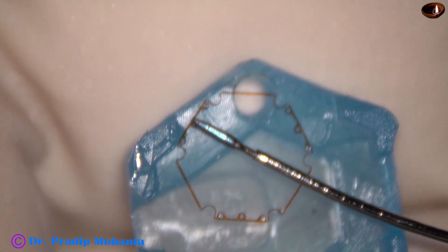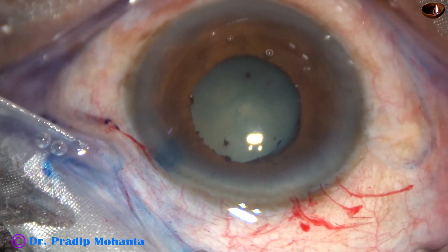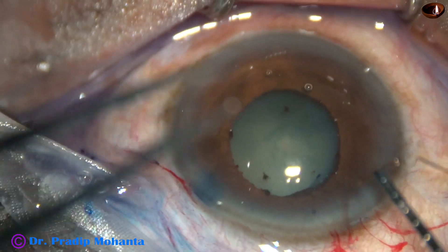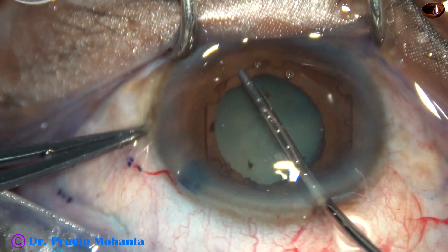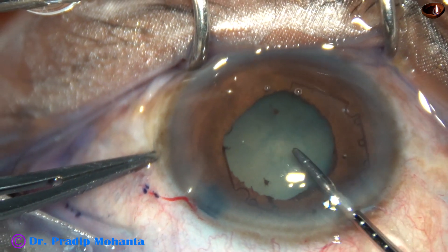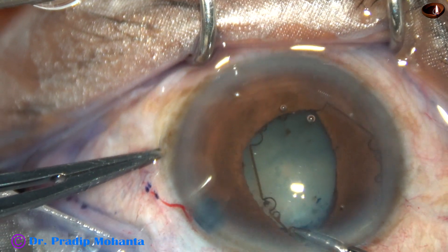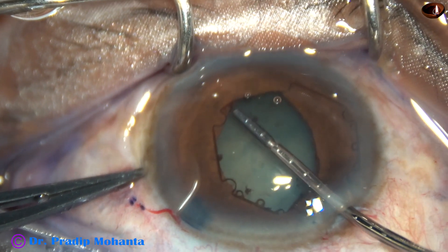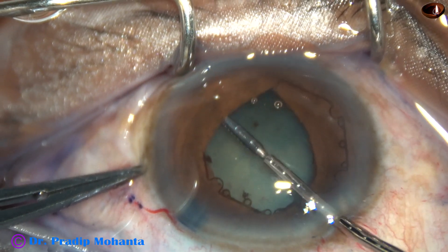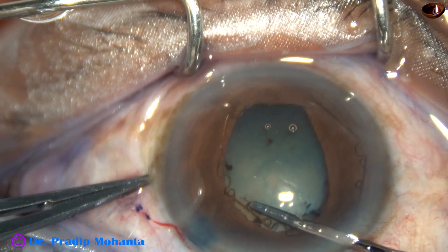I can now use the B-hex pupil expansion device, invented by Dr. Subhan Bhattacharji of Kolkata, West Bengal, India. This is a beautiful device for small pupils. It doesn't cause any sphincter tear — that is the beautiful advantage of this device. It dilates the pupil only 5.5 mm and doesn't cause much stress on the sphincter pupil. The sphincter remains intact, and at the conclusion of surgery, the pupil is round.